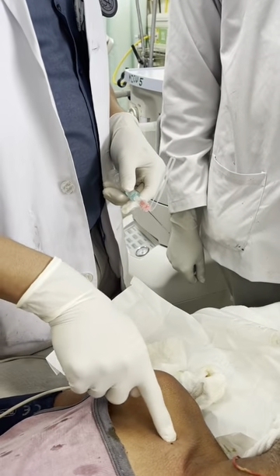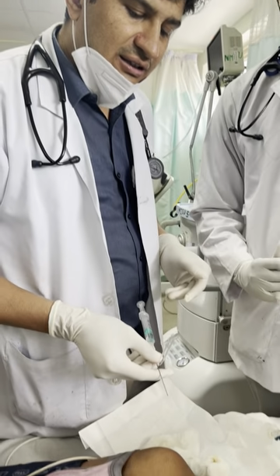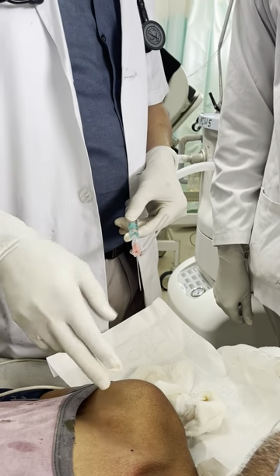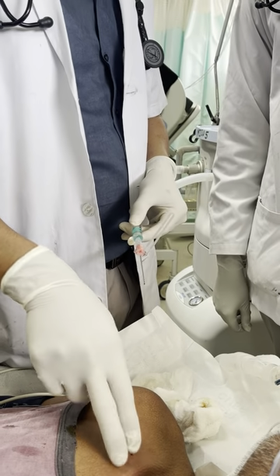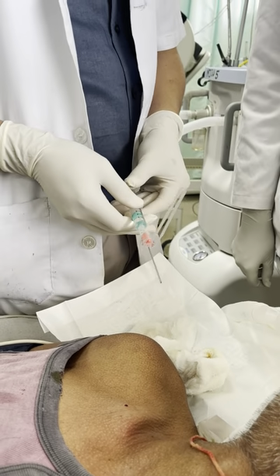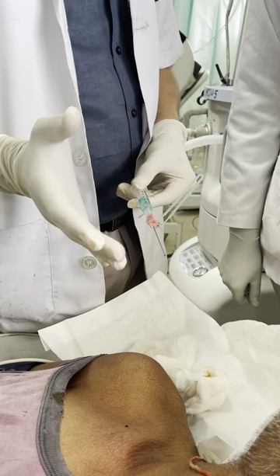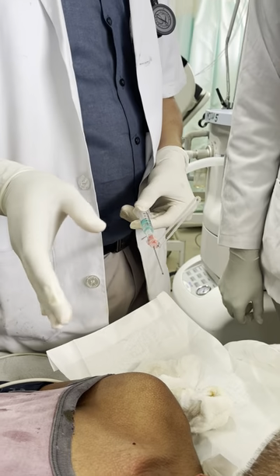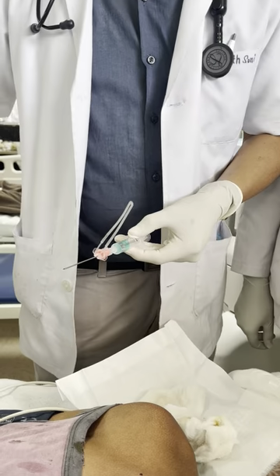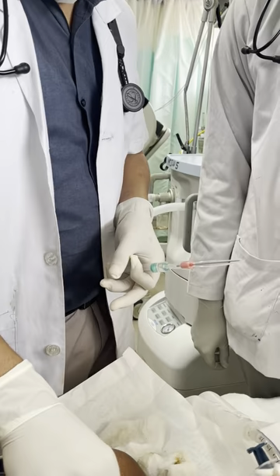In an obese patient, initially you have to go like this, then like this. See the direction of the needle. In a lean and thin patient where the clavicle is quite prominent, you will approach the subclavian vein. Superior to the subclavian vein lies the subclavian artery. Before reaching the artery, you will puncture the vein. So our aim is the vein, not the artery.